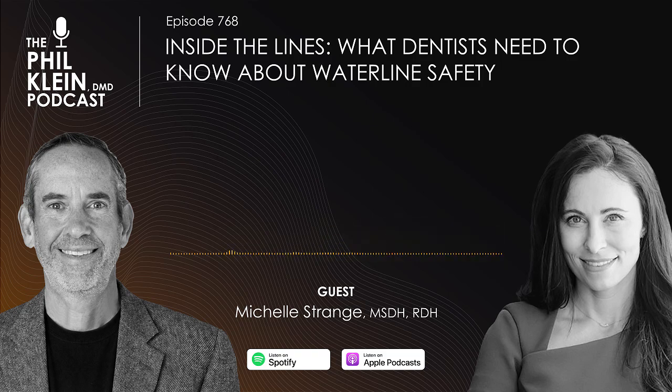So you're not guessing, you're not hoping, you actually know that what you do day in and day out is truly maintaining your dental unit water lines to keep them below 500 colony forming units, which is the EPA's recommendation for safe drinking water. So testing is an absolute must. Shock is going to knock down that biofilm, and maintaining or treating is what's going to keep it below that 500 colony forming units in between your shock and your test. Right.